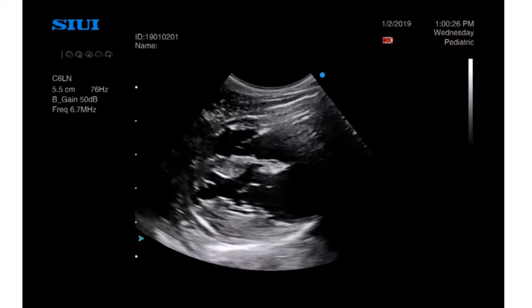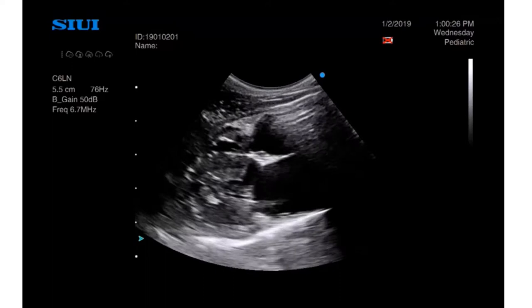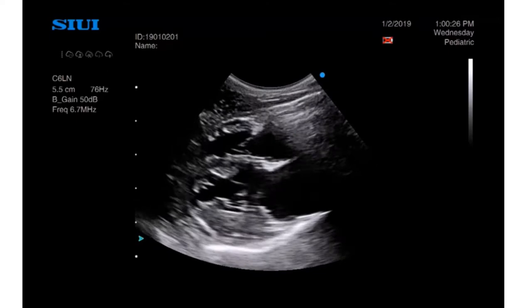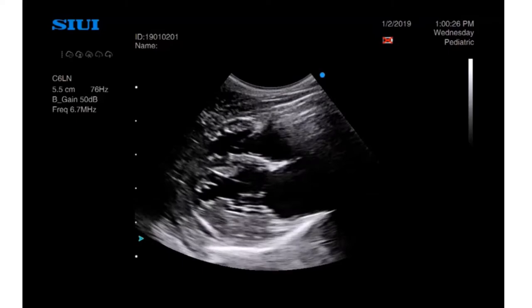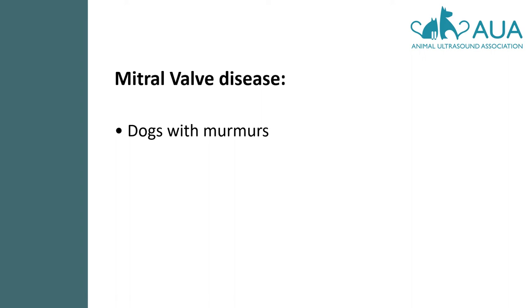Here's an example from another cat, and this time we're looking at the right parasternal long axis. Although the systolic function appears good, the entire movement of the heart muscle just seems very stiff in comparison with a healthy heart. You also have other clues here, such as the size of the left atrium — almost as big as the ventricle — which, in the absence of significant mitral valve disease, is another sign of diastolic dysfunction, and in this case, HCM.